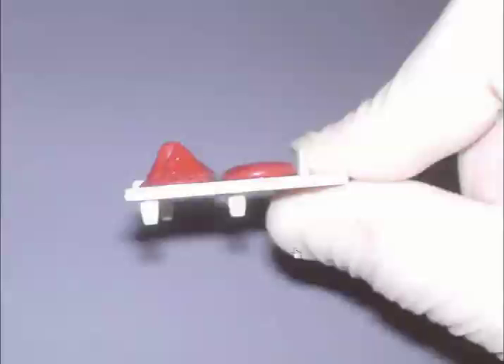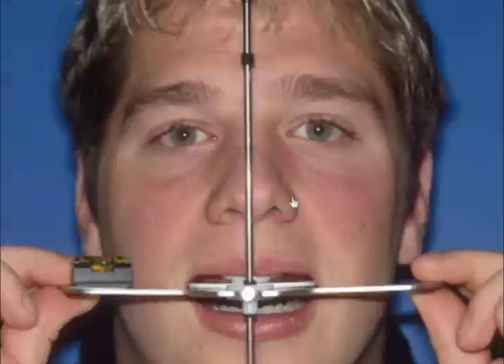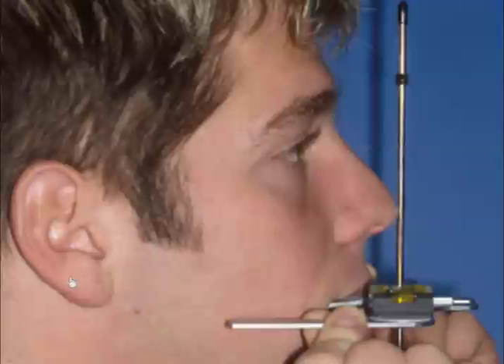Well, step 1 is to set the wall that's on the Kois index tray to the central incisor, picking up 1 point of that axis incisal distance for function. Step 2 is get the vertical rod to facial midline. Well, what is facial midline? I like to split the eyes and use the philtrum of the lip, but you have to decide what facial midline is. We can also see that the lateral wings going down the side of the face are approximately level, and then we come straight up to whatever tooth is lowest in the arch, hits the tray, and stop.